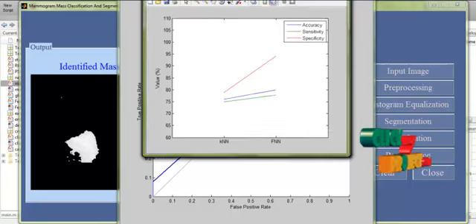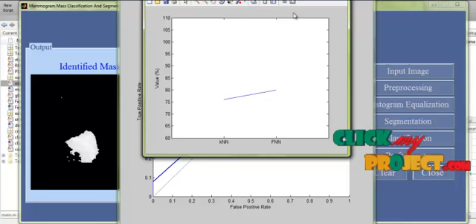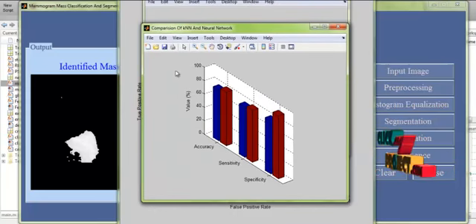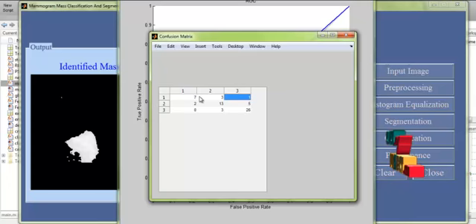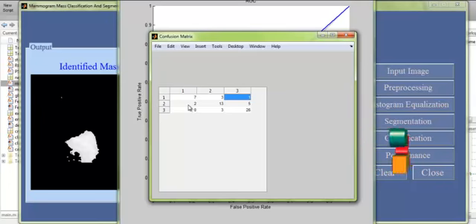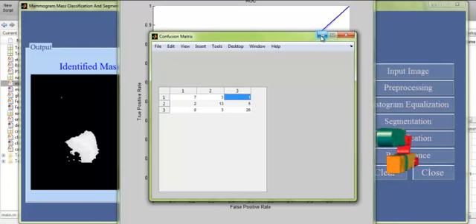So as the result, we have plotted all the values that we got as graphical representations, and finally we have depicted all the values in a comparison chart, and this is the confusion matrix obtained. So we have three categories. So this confusion matrix depicts the number of images that we have provided for each category, and the training samples that we have provided, based on the results, will be calculated in the confusion matrix.